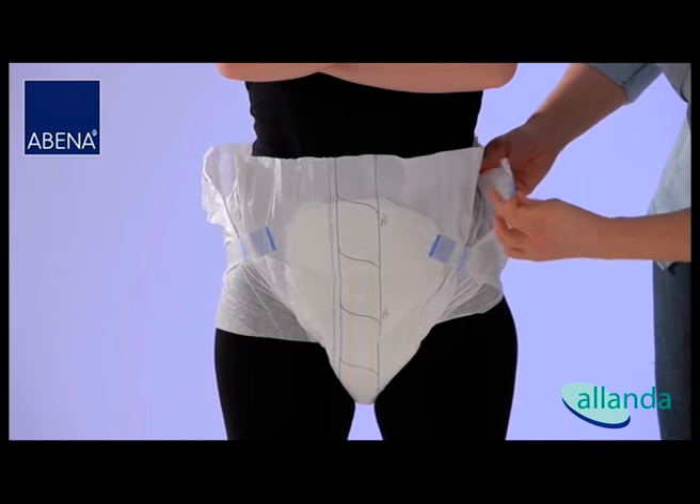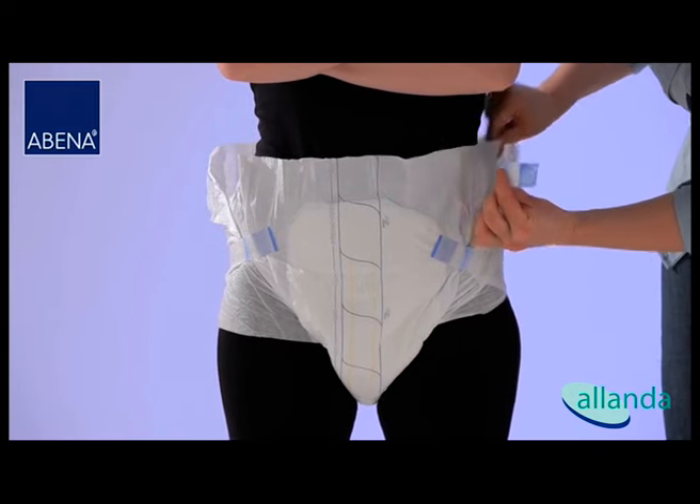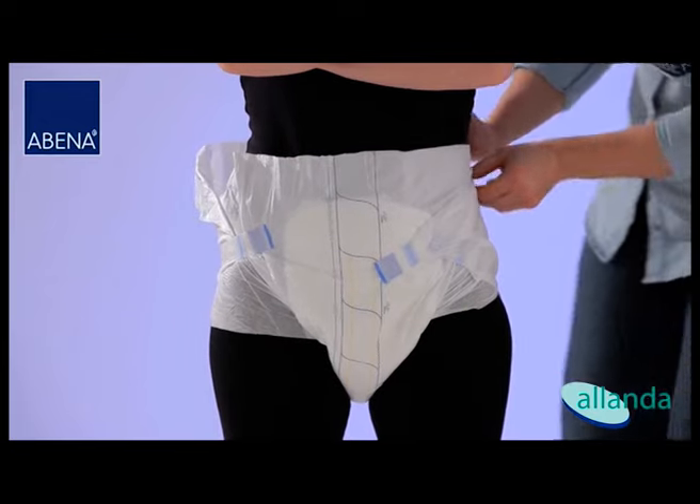Attach the upper tapes obliquely downwards. This ensures a perfect fit of the Abri-Form around the back and the abdomen.